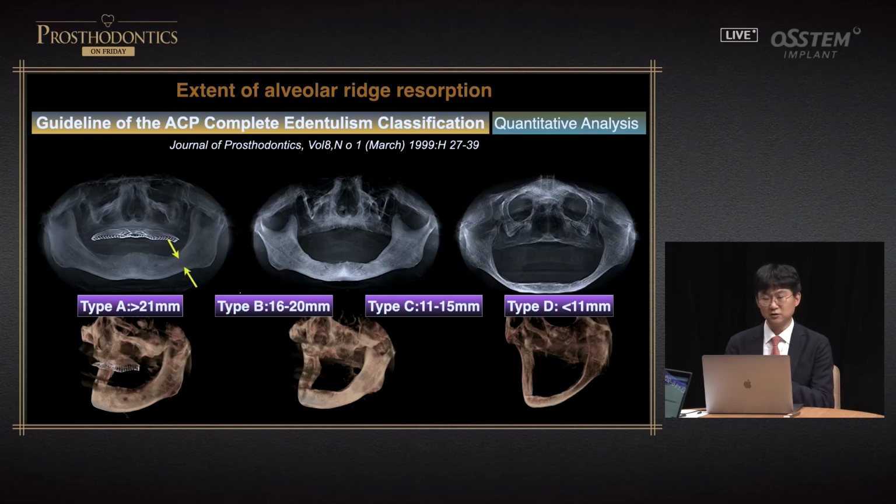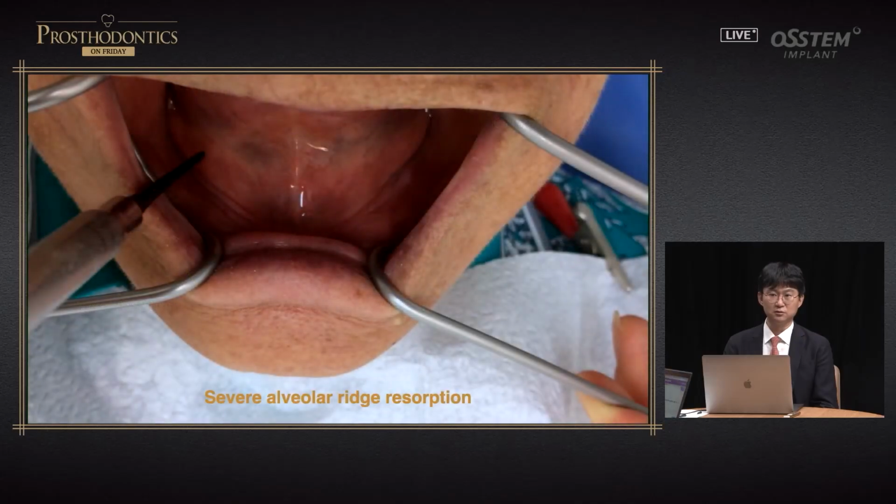Alveolar ridge resorption is very important, but clinically, I find unstable factors of TMJ pose a lot of difficulties. The treatment was successful in this patient. Impressions were taken, and a recording base was fabricated, which can have some errors. In this type of patient, the base should be stable in the mouth.